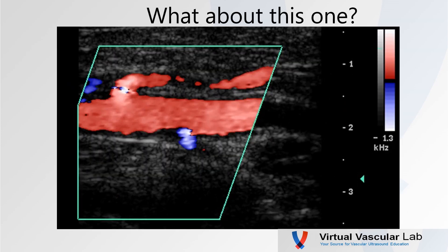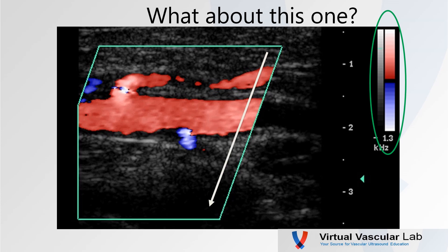Let's revisit this popliteal artery. Check our color box: flow towards is red, flow away is blue. The box is steered to the left. The popliteal artery shows flow towards the transducer — proper direction, left to right. The collateral on top is red — flow towards the transducer, so that's an outflow collateral. The collateral off the bottom is blue — flow away from the transducer — also outflow. This is a normal appearance.